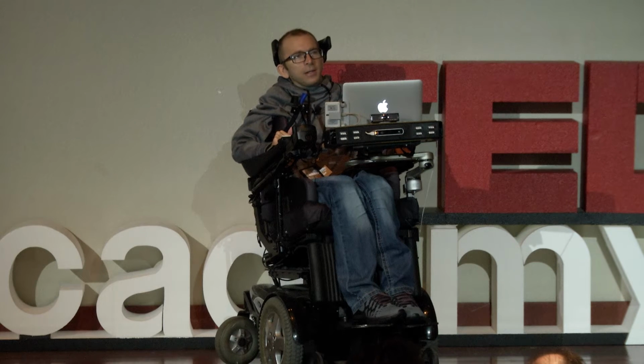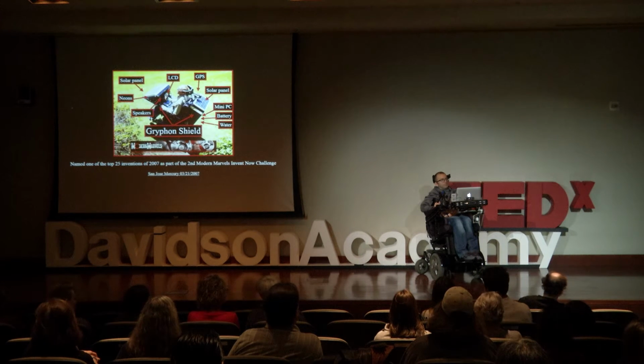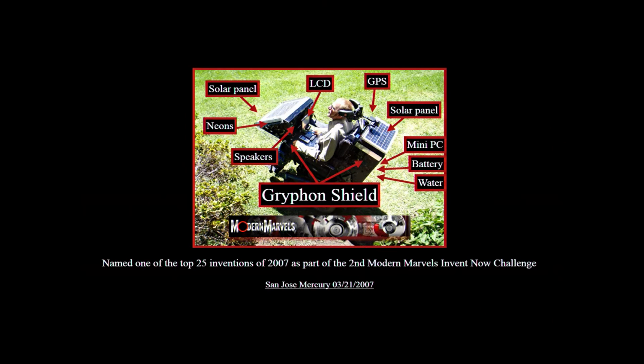I had a traumatic spinal cord injury 20 years ago, and I've been paralyzed from my shoulders down ever since. 2 years after my accident, I got an internship at NASA, and I've been modifying my power wheelchair ever since. Next slide, please. By 2007, I had accumulated quite a bit of useful stuff.